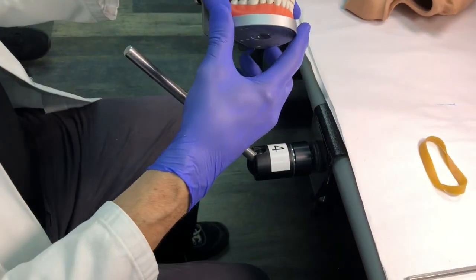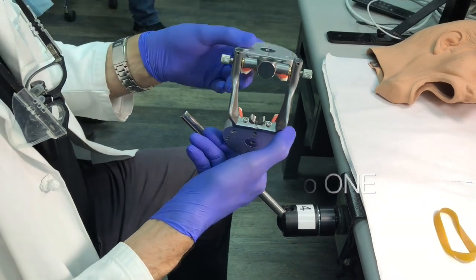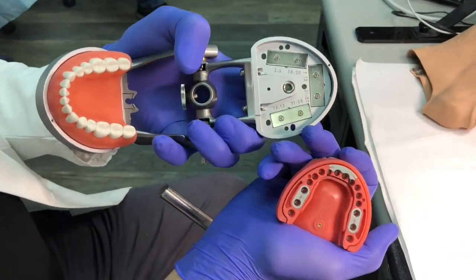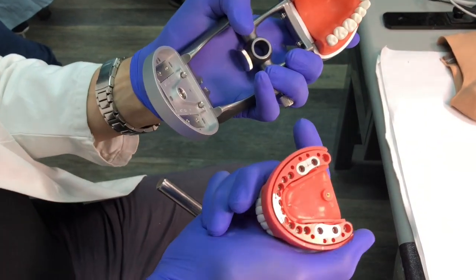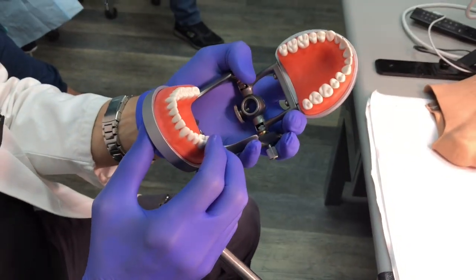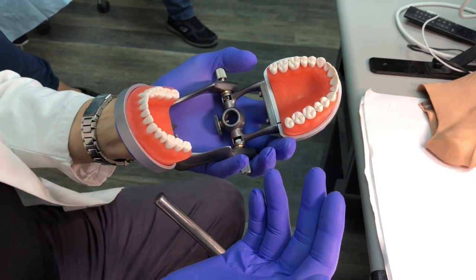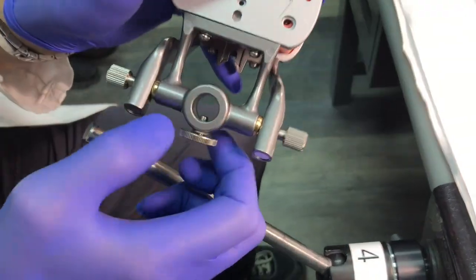I'm going to utilize an Accidental typodont — this is the Module Pro One. It's a great system that a lot of schools are going with now because of its versatility. These are called carrier trays; they're magnetized and the little replacement arches click into place. They're used by the NBDE exam and many dental schools are switching to this system because it can be used in both endo and operative/restorative dentistry.